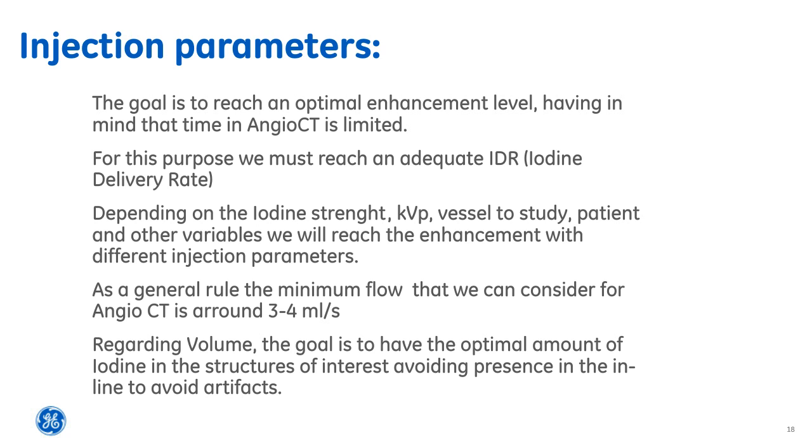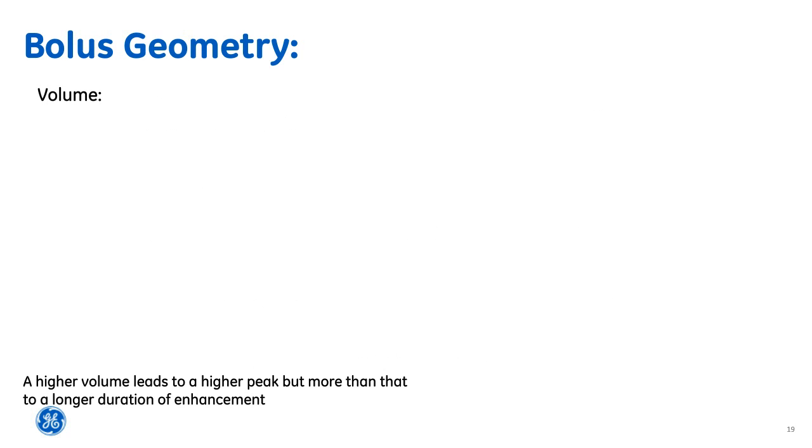But obviously because we can now acquire whole body scans in a matter of 3-4 seconds, this means that we can inject far faster to keep the bolus of contrast nice and tight.